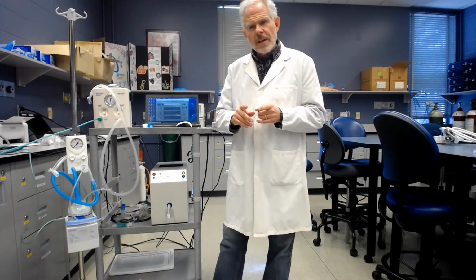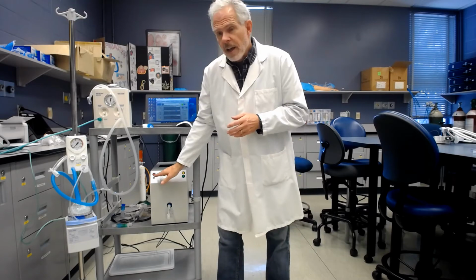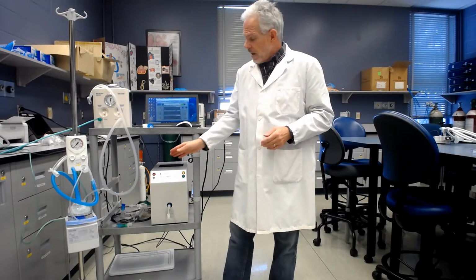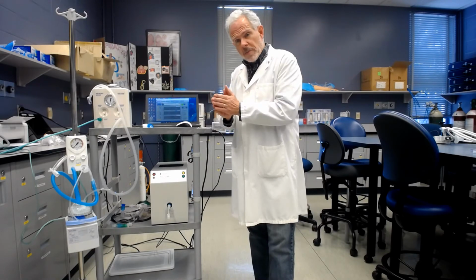And I'm also going to measure to see if there's any noticeable differences with a positive pressure breath. So I'm going to be switching my lung simulator, the ASL 5000, from a spontaneous breathing mode where the ASL is mimicking a newborn's breath, and I'll tell you what those settings are in just a second, and comparing that to a positive pressure breath being delivered.